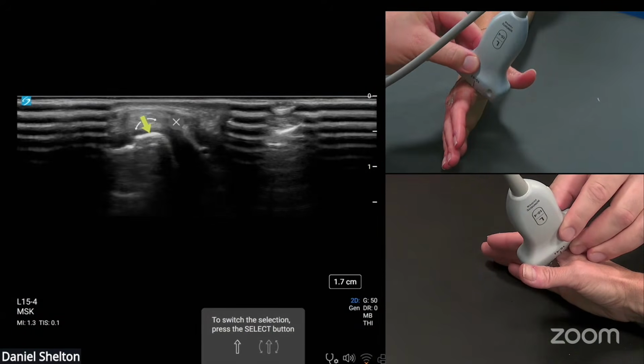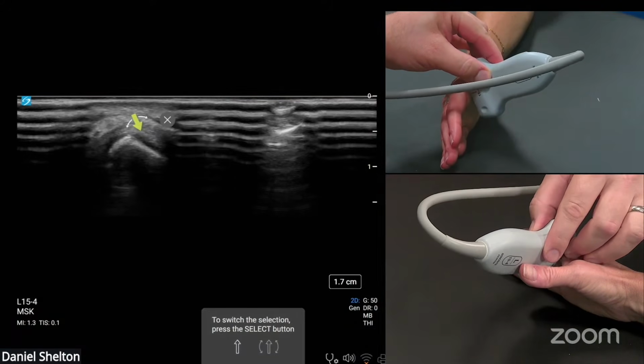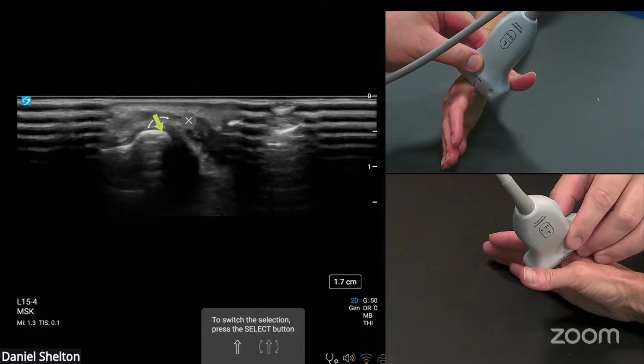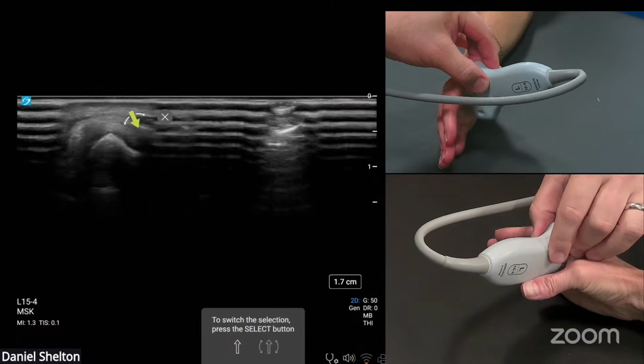We see we're still on the metacarpal. I'll start to see cartilage, articular hyaline cartilage on the volar surface, but you can see how that accessory collateral ligament here turns into a volar plate, just like that. So now we are looking at a volar plate.